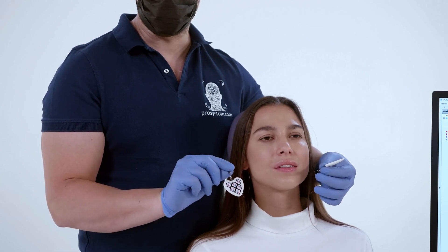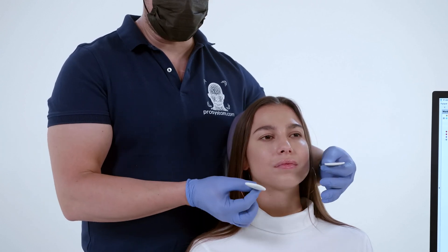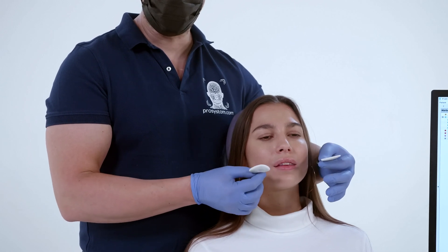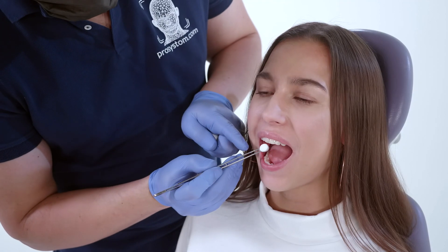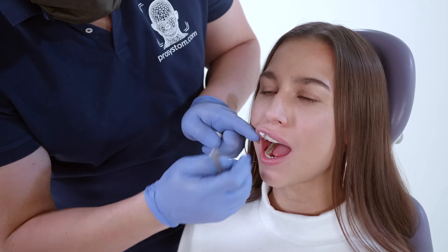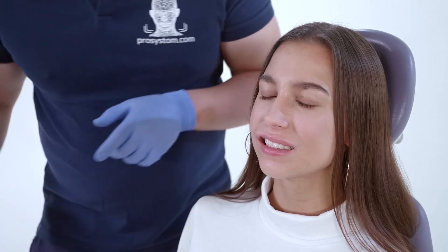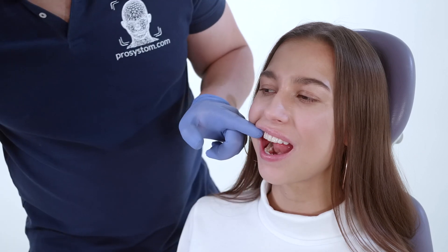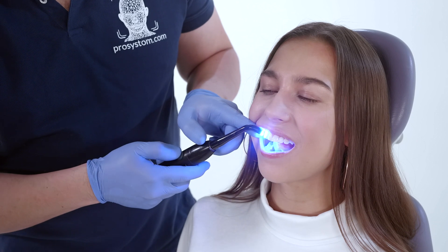To fix the markers, an adhesive and a flowable composite are used. The adhesive is applied to the vestibular surface of the tooth. The composite material is applied to the marker holder and to the vestibular surface of the tooth. This is how the side markers are fixed. The lower marker must be fixed when the dentition is articulated, so that the fixation of the marker does not distort the usual closure of the dentition.